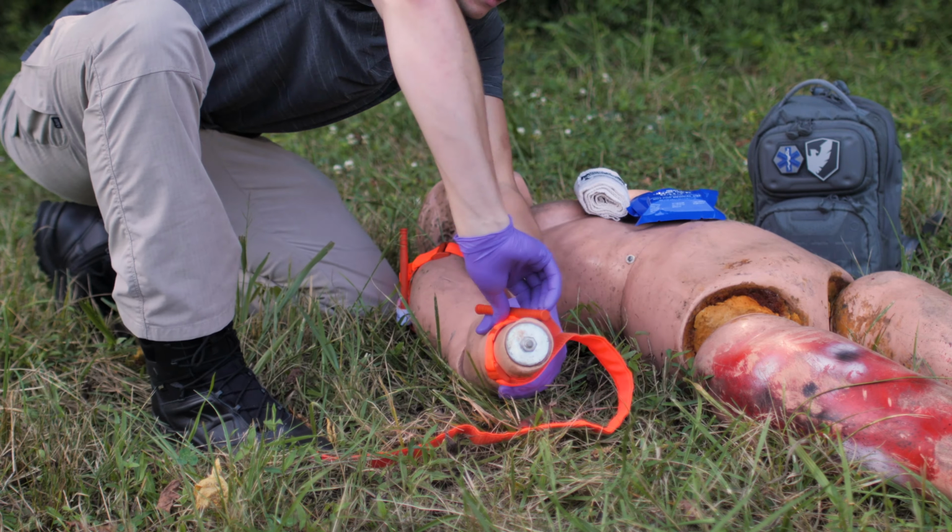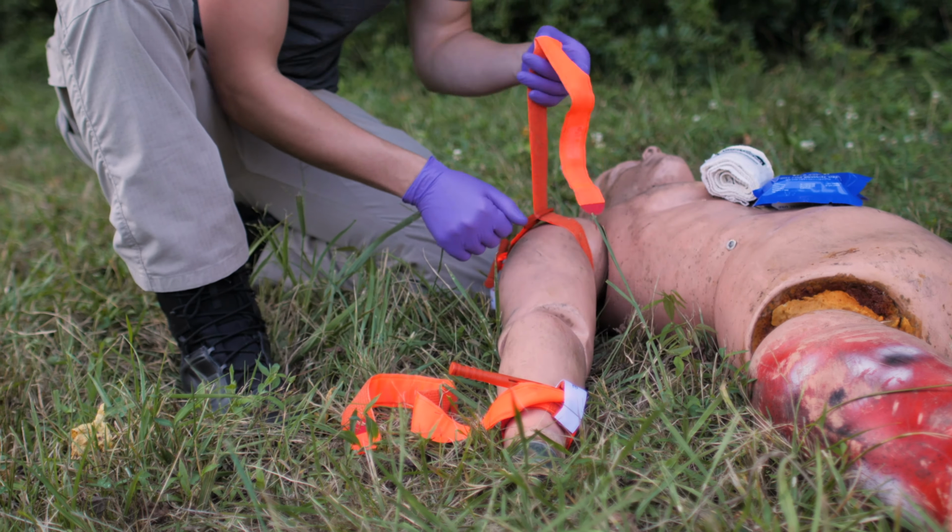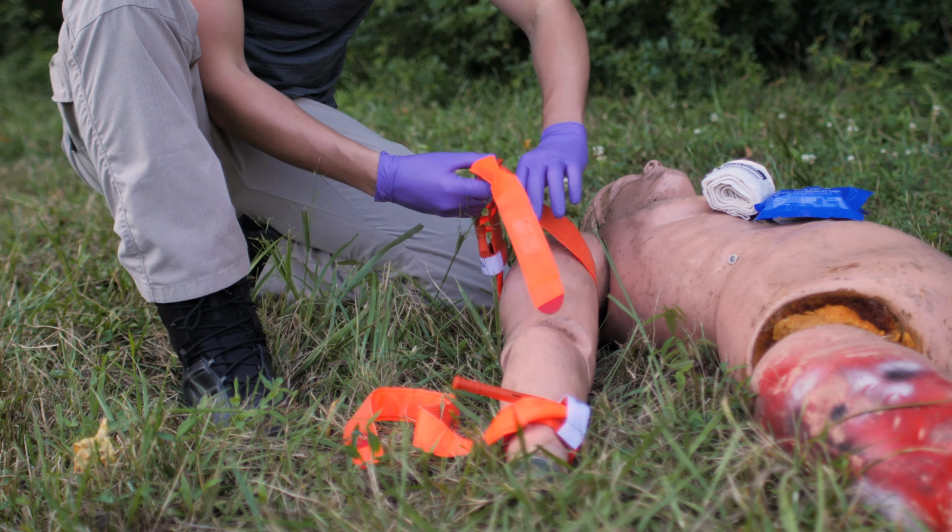So if this person has a bunch of clothes on and they're bleeding, we can throw that tourniquet high and tight, throw it on them, stop that bleeding, and then this would be the time we reassess and we go, oh, they're bleeding down here in the lower arm. We can put a tourniquet 2 to 3 inches above that wound, tighten it down, and then we can remove that tourniquet from the upper extremity. When we move that tourniquet, what we're doing is we're allowing more blood flow to this other tissue that has currently not had blood flow.